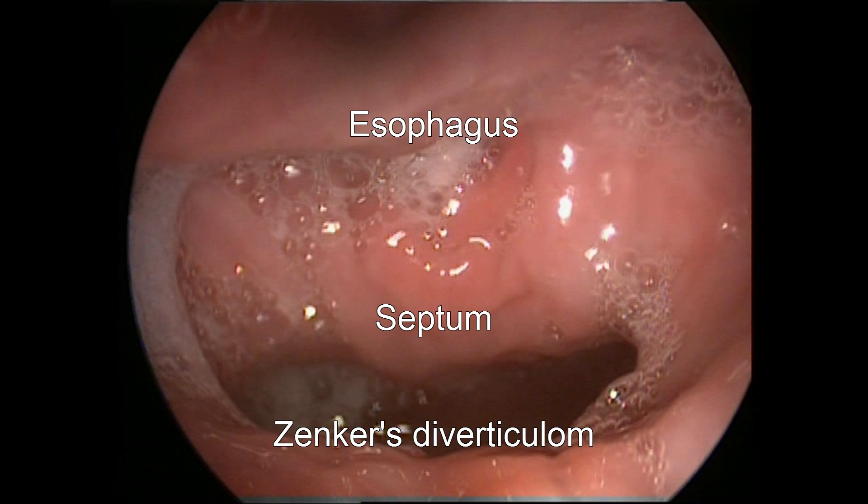Let me freeze the picture for a second. The cavity you can see in the inferior part of the picture is the Zenker's diverticular cavity itself. The wall above it is the anterior wall of the diverticulum and the posterior wall of the esophagus. Therefore, it's called the septum. It contains the cricopharyngeus muscle, and the lumen above is the esophagus itself.